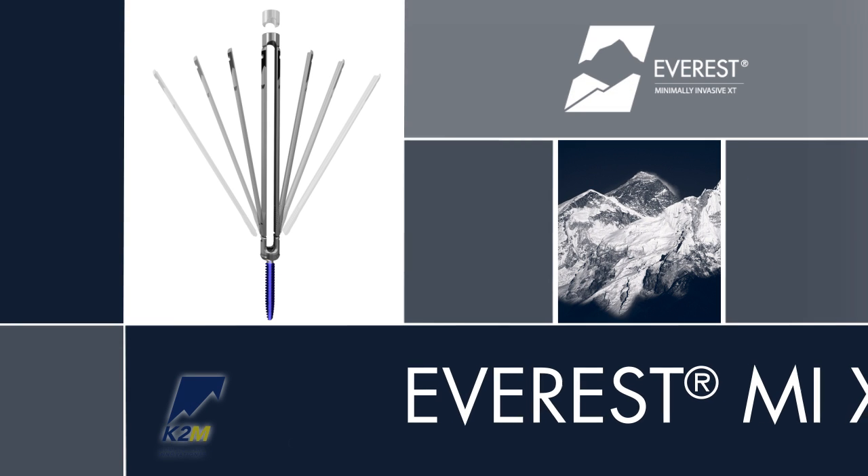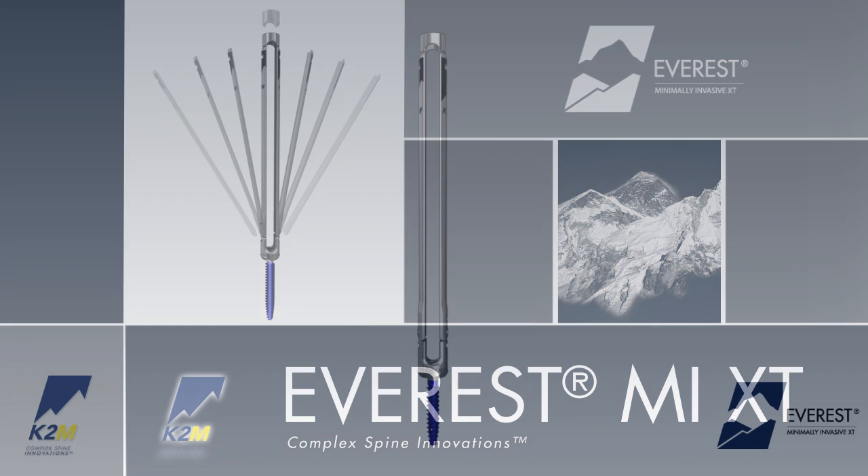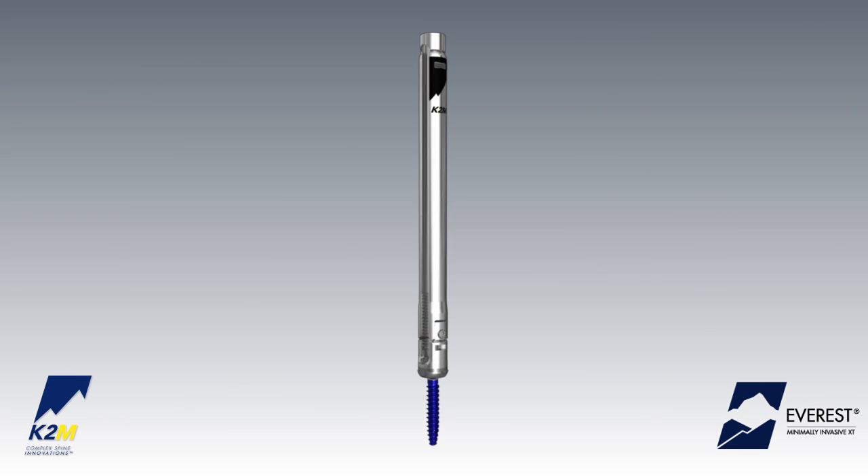Introducing the Everest Minimally Invasive XT Spinal System from K2M, Complex Spine Innovations. As an extension of the Everest Spinal System, Everest MIXT offers the core features and benefits of Everest technology through a minimally invasive approach.